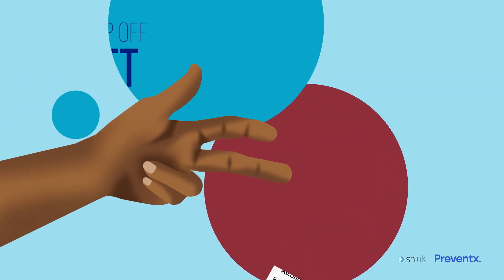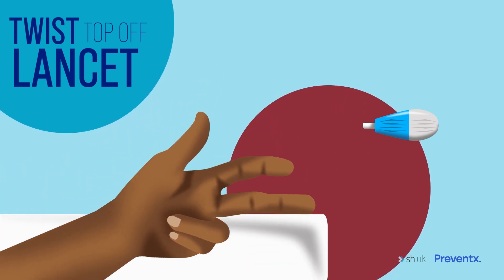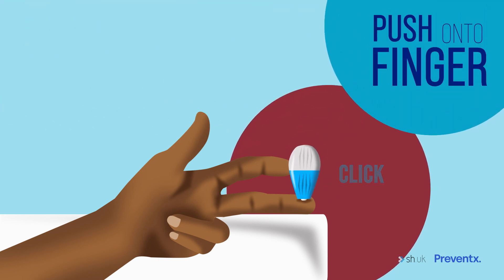Twist off the top of the lancet. The safety lancet is designed to prick your finger with a small hidden needle and will only work once. Place your hand facing palm up on a firm surface to keep your finger still, then push the lancet firmly into the side of your finger until you hear a click.